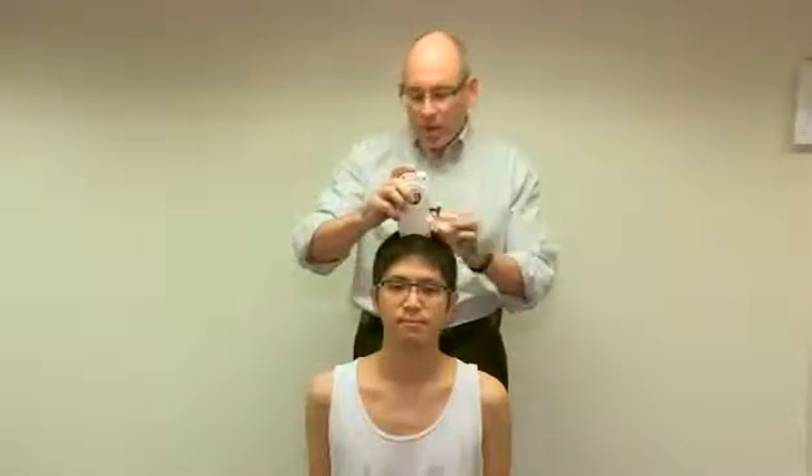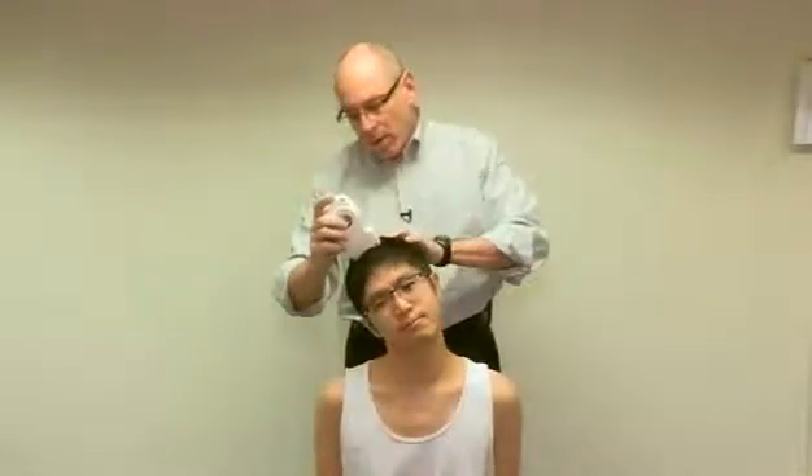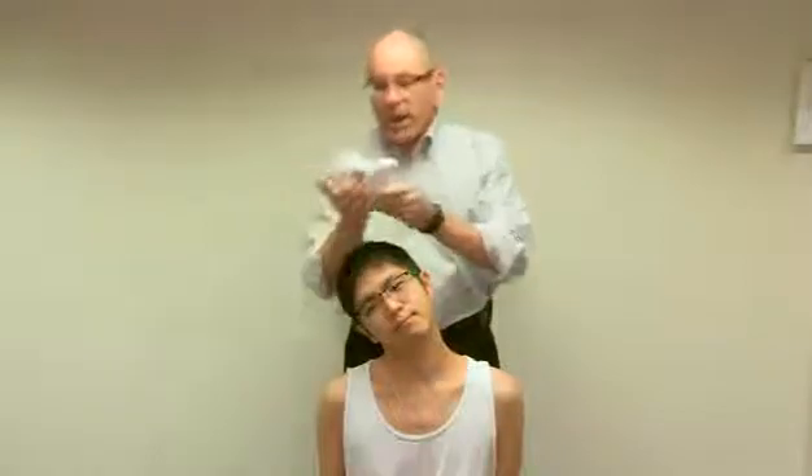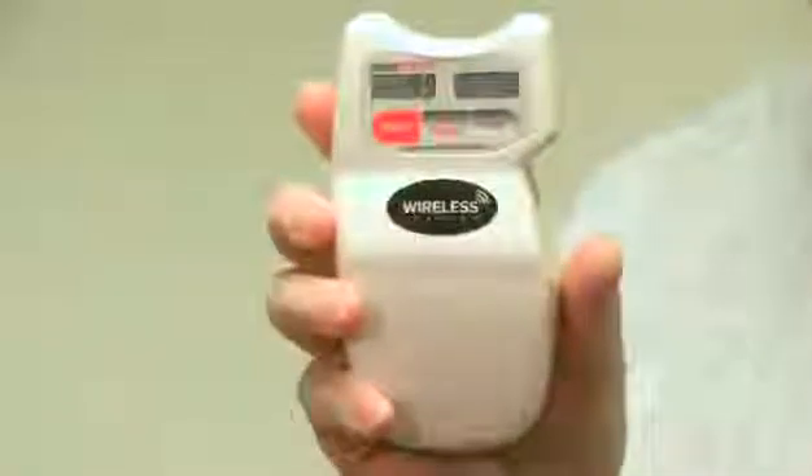Now we're going to measure right lateral neck flexion. I place the inclinometer on the top of his head and set it. Tilt your head to the right as far as you can. I set it again. We have 49 degrees of right lateral neck flexion.